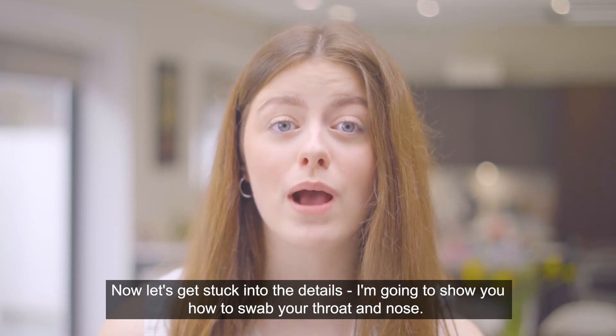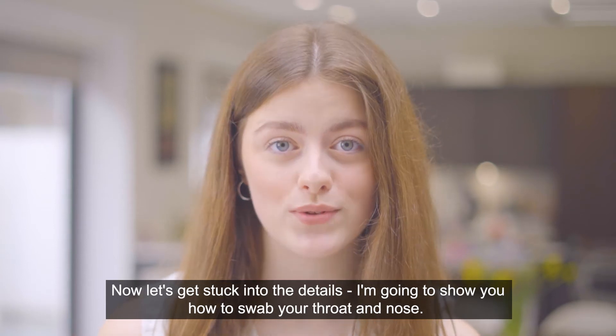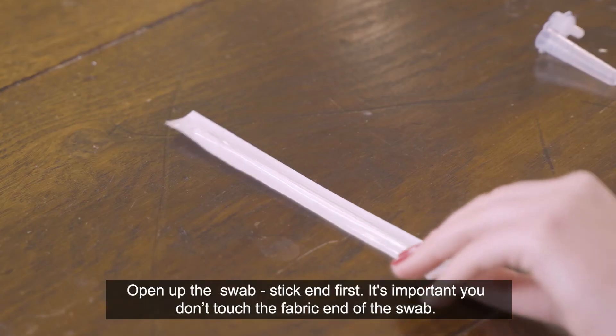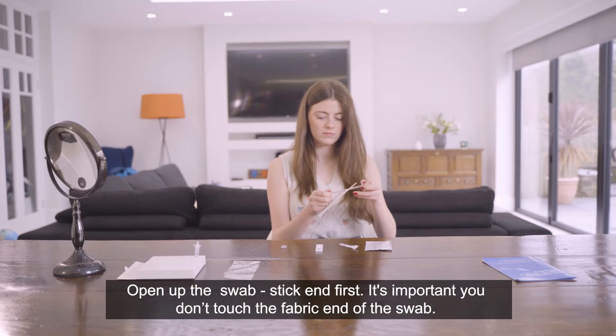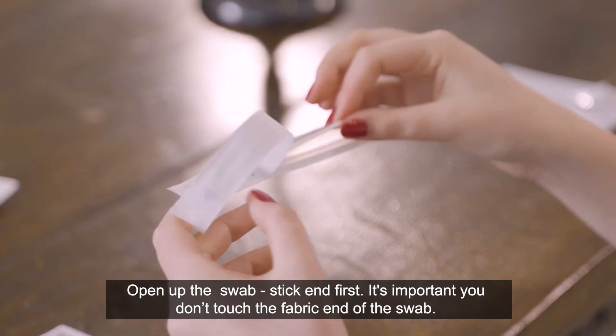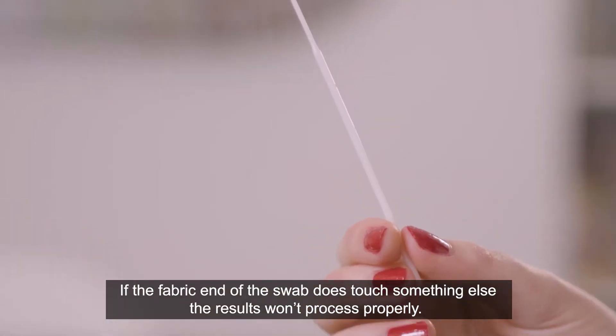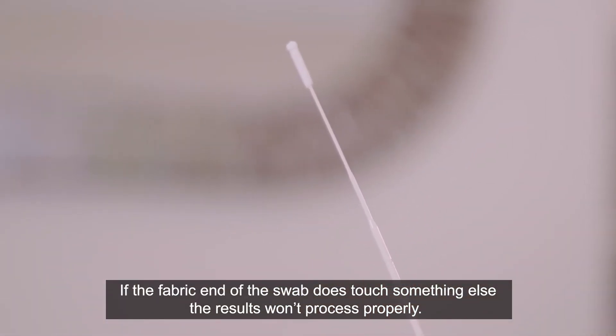Now let's get stuck into the details. I'm going to show you how to swab your throat and nose. Step 1: open the swab stick end first. It's important you don't touch the fabric end of the swab. If the fabric end of the swab does touch something else, the results won't process properly.